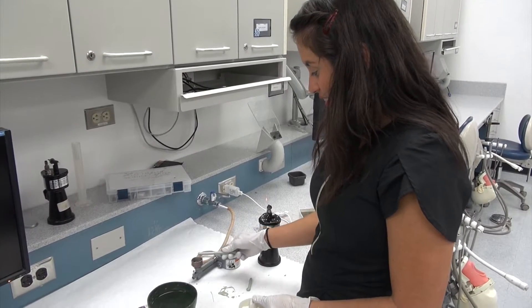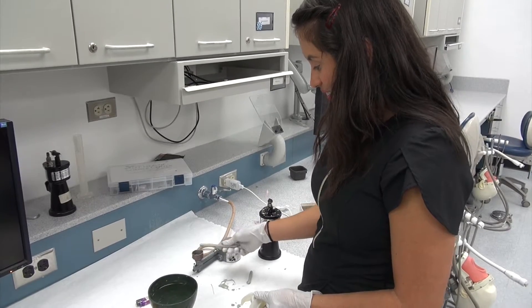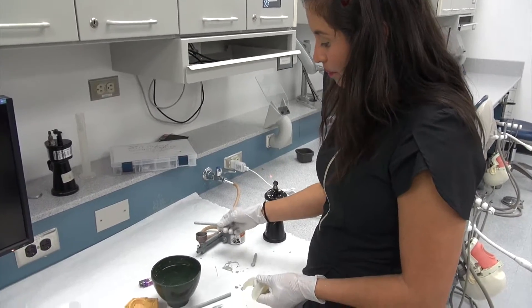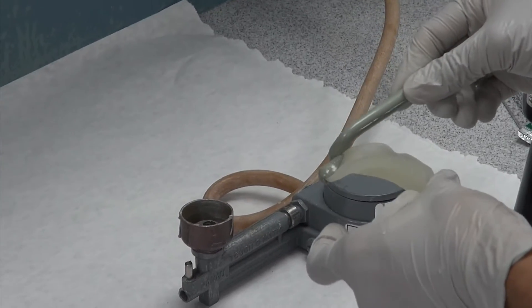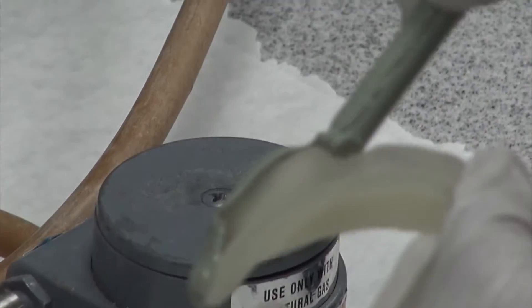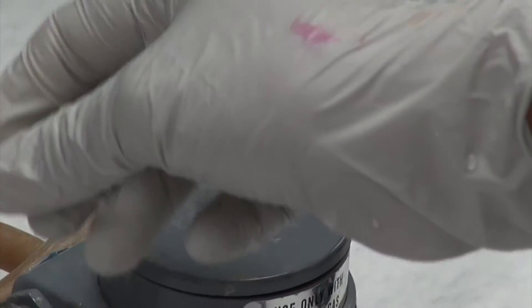Okay, so we're going to melt the compound. Trying to apply it to the very border, not going too much onto the lingual.